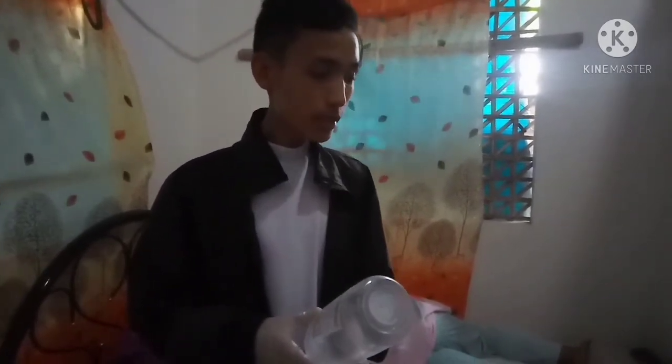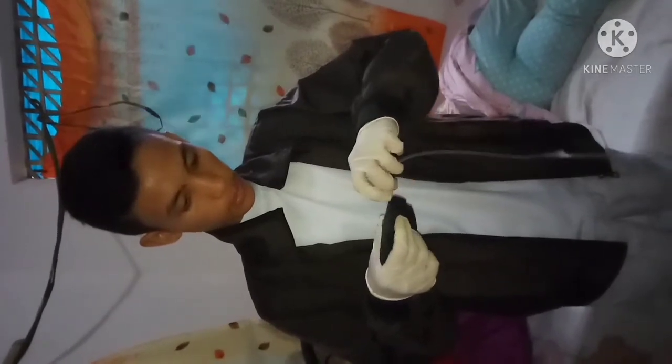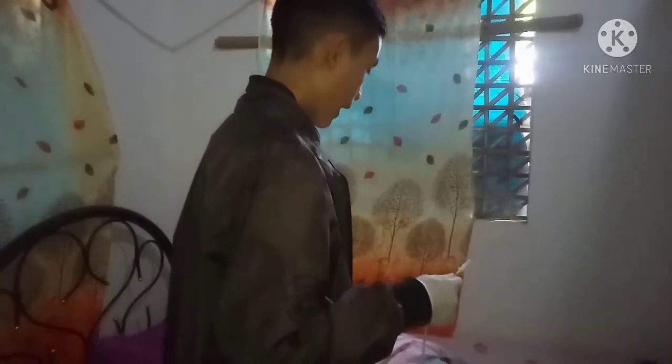Our first administration is the pre-packed disposable enema. We need to remove the cap of the enema and make sure to lubricate it. It would avoid any discomfort as we insert it into the buttocks of the client. So, we need to go to the client. Make sure that the buttocks or the anal area of the patient is exposed. We need to ask the client to take a deep breath as we insert the tip of the enema.